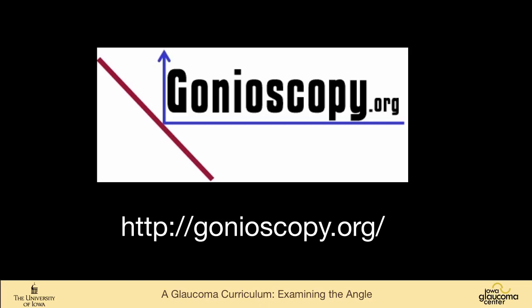But for the ophthalmologist in his or her clinic, gonioscopy is still a critical technique to know, not just to determine angular width, but to determine pigmentation, neovascularization, all sorts of things that OCT and biomicroscopy can't show you. I do have a website, gonioscopy.org, that has lots of examples of gonioscopy techniques and findings.